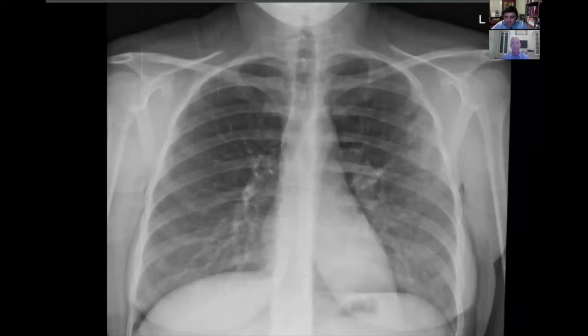Sure. Excellent. Yeah, that's a great start. Urgent care x-rays, what I tell our radiologists when they join the group is that it's pretty simple stuff, but it's not necessarily easy because you do have to pay attention to detail. And the best way to do that, I found, is to have a systematic approach, as you said, almost like a checklist kind of process.